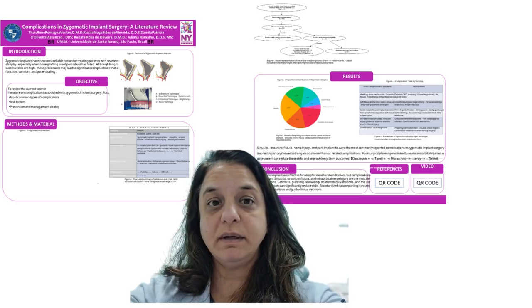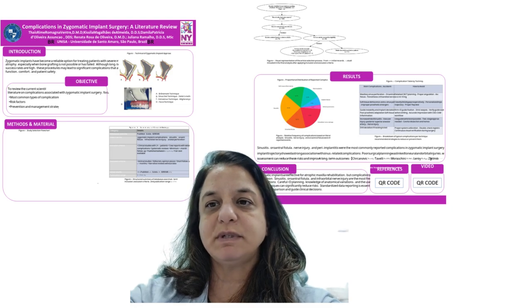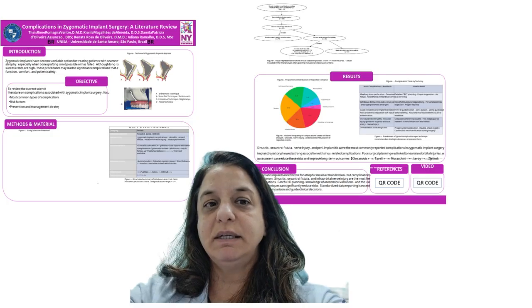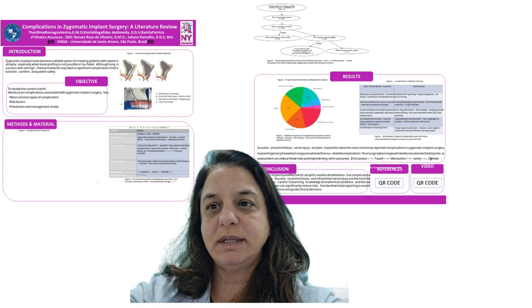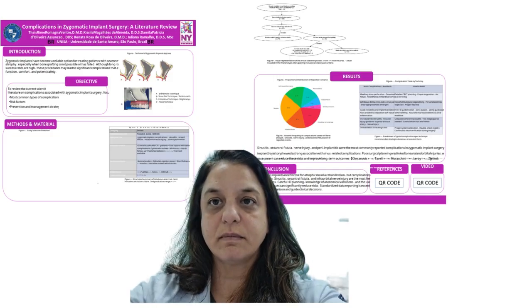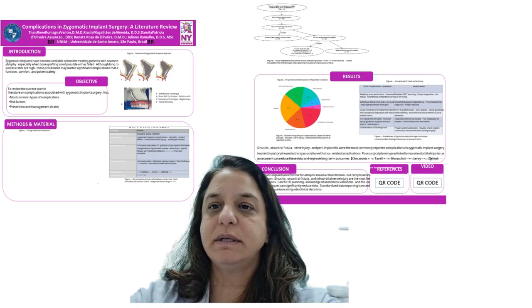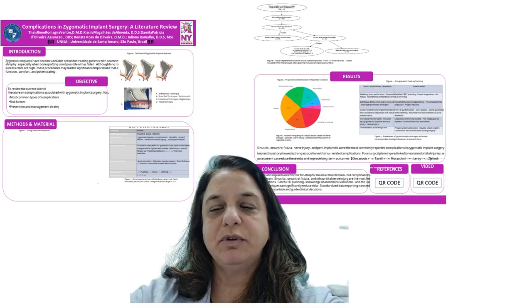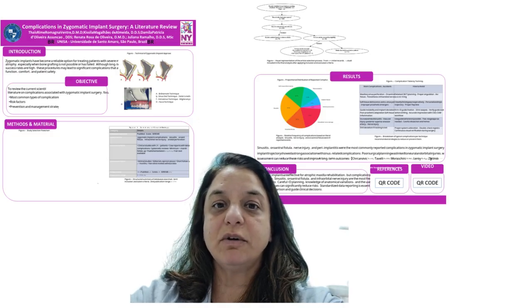In 2021, Dr. Elton Faco developed the Faco technique, aiming to improve prosthetic aesthetics and fit. This technique introduced the Z abutment, pillar Z, which involves the placement of a more stable implant and the subsequent adaptation of the Z abutment into it. The most common accidents and complications include sinusitis or oroantral fistula, infraorbital nerve injury, fracture of components, and soft tissue injury, among others.